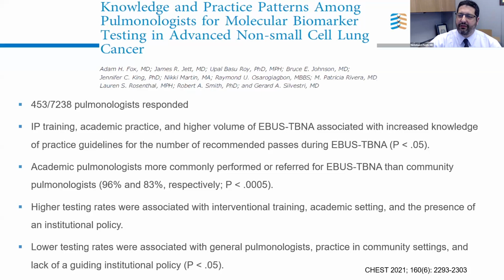of pulmonologists performing EBUS globally that are sending molecular analysis. Some studies have shown even as low as only 20%. So I think that's what piqued his interest and his research group's interest in looking at what factors are associated with ordering or not ordering these molecular tests in patients, when we know if they have one of these, they may have improved survival, actually. So it's actually very important.